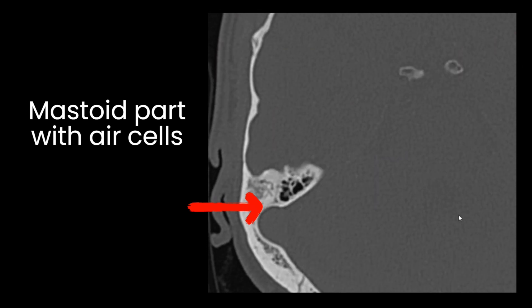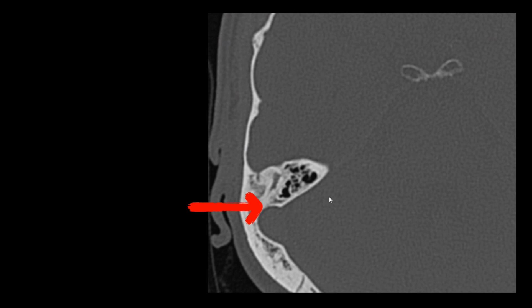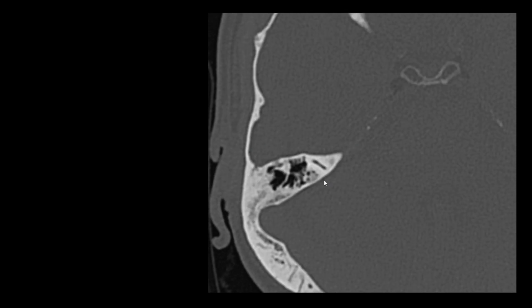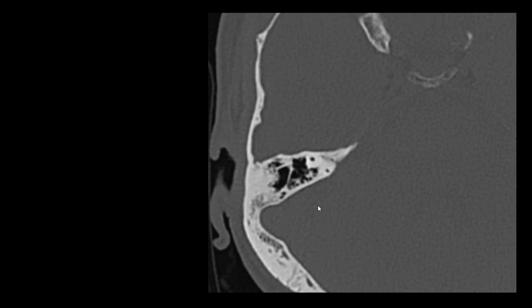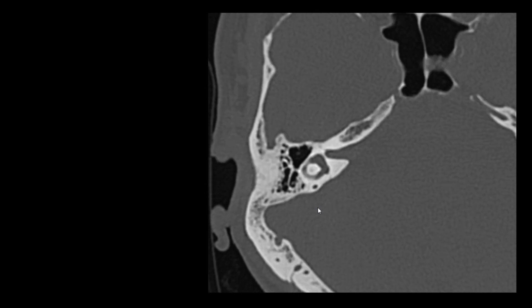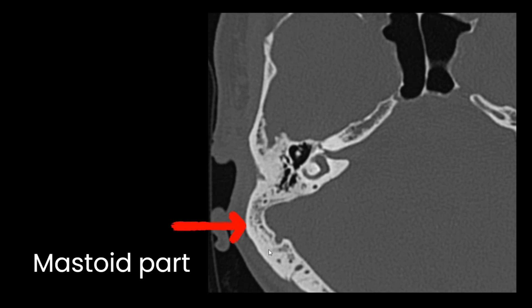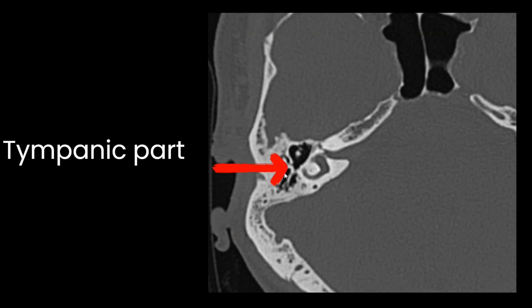We will see these temporal bone parts on axial HRCT sections. Here we can see the mastoid part of temporal bone with mastoid air cells — air-filled cells with bony lamellae in between. As we move down, the mastoid part continues. Now the middle ear sections have appeared; this is still the mastoid part up to the mastoid process, and where the middle ear exists is the tympanic part of temporal bone.